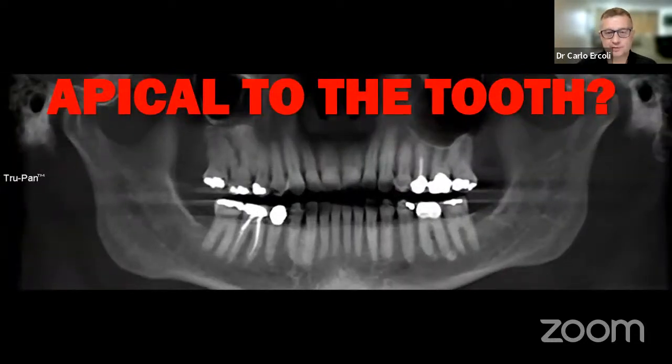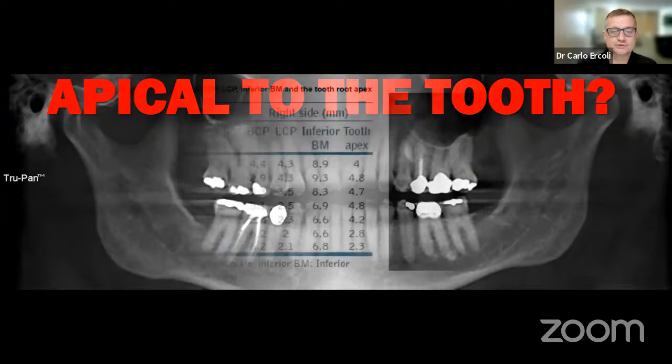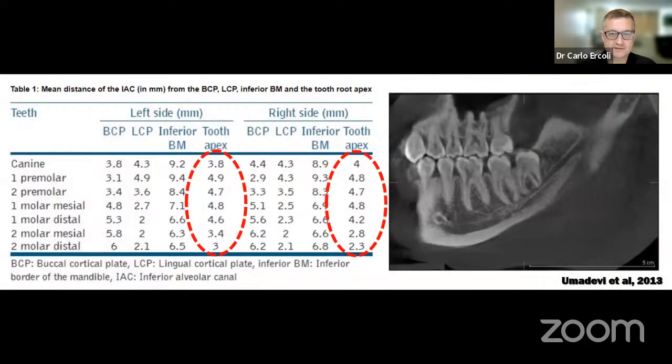So then the question is, how do we stabilize the implant? Can you stabilize it apical to the tooth? Is there enough bone to place that implant and stabilize it at the expense of some bone apical to the socket? Well, we need to go back to anatomy, both in the maxilla and the mandible. If we look at the distance between the apex of the root of the mandibular posterior teeth and the inferior alveolar canal, we notice that distance is anywhere between 3 and 4 millimeters. Now, we know from a safety standpoint that we should be roughly 2 millimeters away from the inferior alveolar canal. So realistically, if the distance is only 3 to 4 and we need to be 2 away, there is no bone that you can use apical to a mandibular molar.